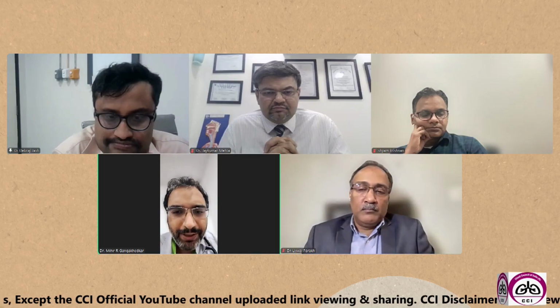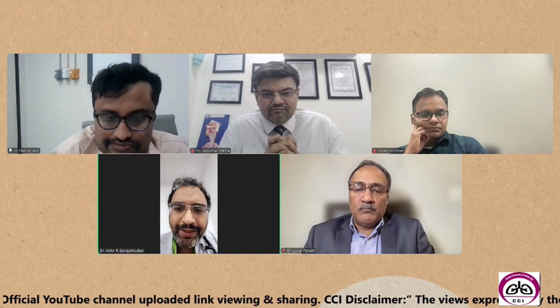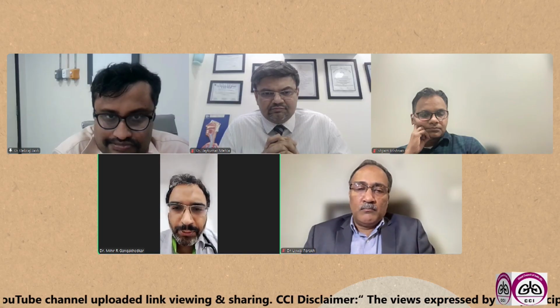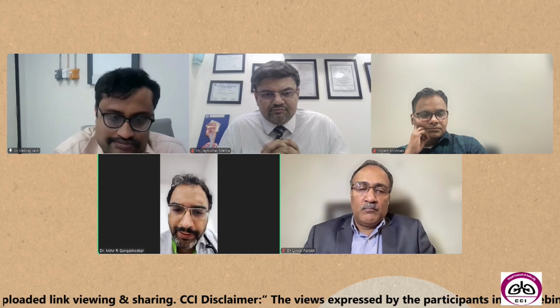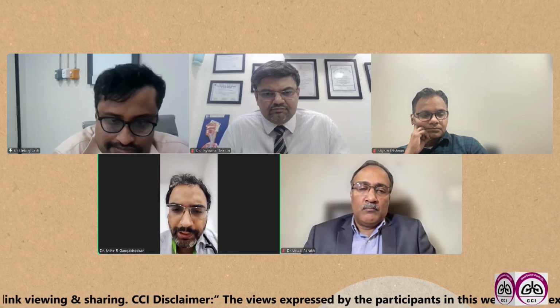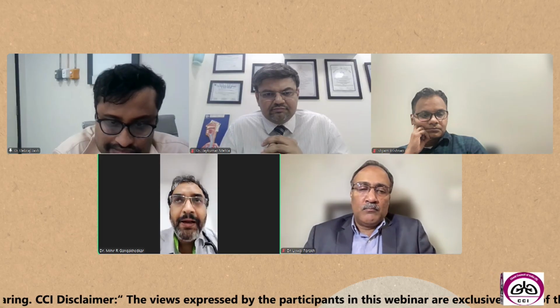In my present practice, I have the fortune of having an anesthetist at hand. If the patient is likely to be able to sustain a good amount of anesthesia, then we generally do it under LMA, or else in borderline patients, we do it under conscious sedation with local anesthesia.